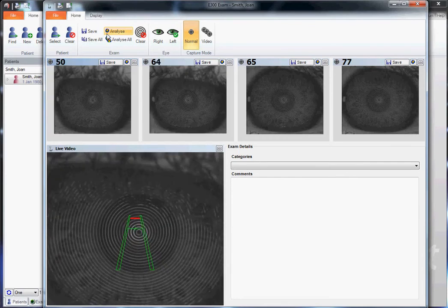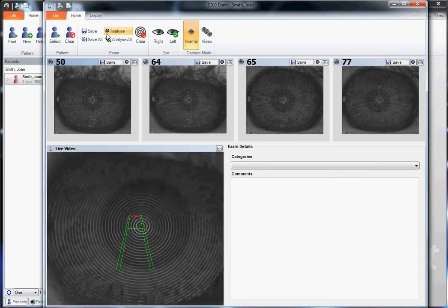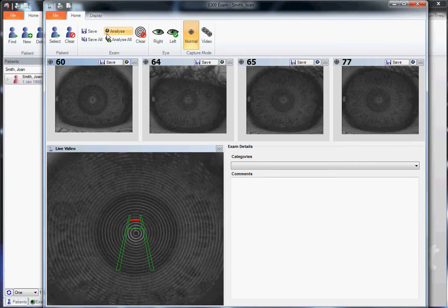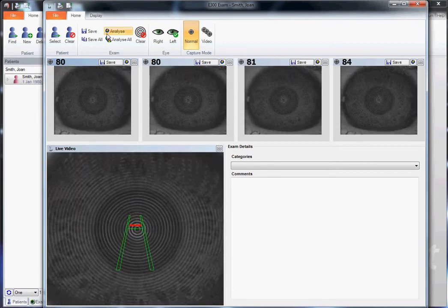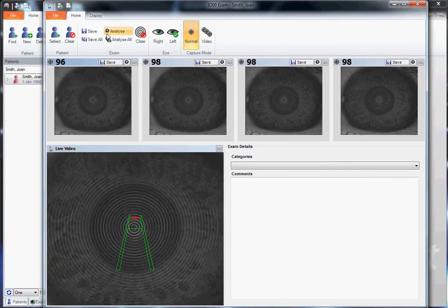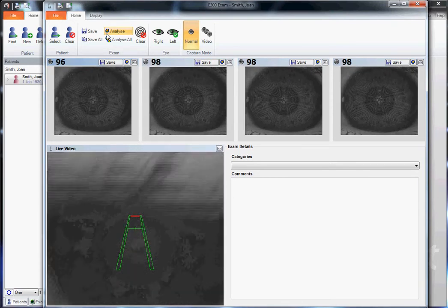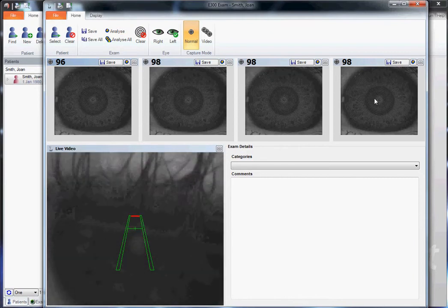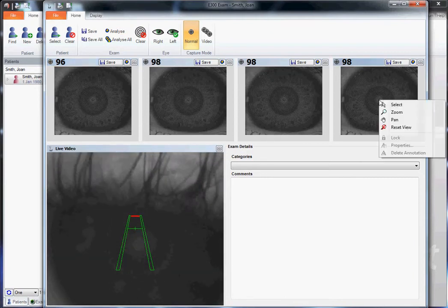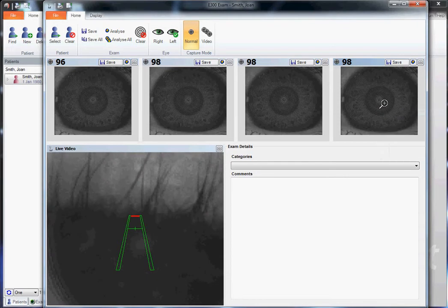Before lining up both green and red over the center, let's ask our patient to open up as wide as possible. Take a blink to smooth out the tear film, then move in to take our capture. Once you have 4 images at the top above 95%, then go over to the rightmost image. It will always be your highest percentage capture, your highest confidence.